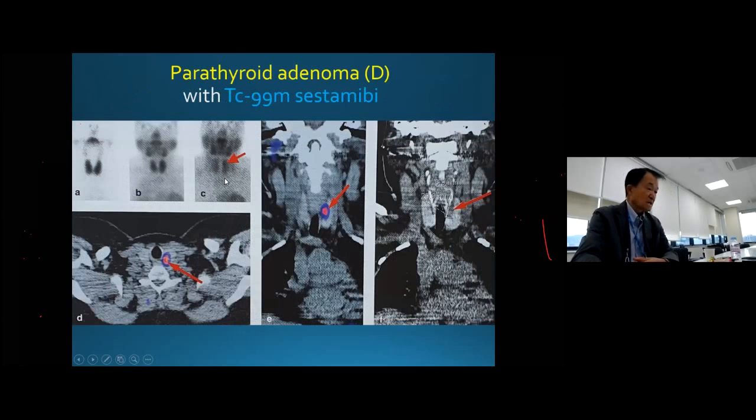In some more cases, like this one, it is right in the middle portion. And that's what we call dangerous because, you see, this is thyroid right in the middle, and the recurrent laryngeal nerve goes right there. So when they resect this kind of case, it requires a lot of special microscopic microsurgery to try to avoid cutting the nerve.